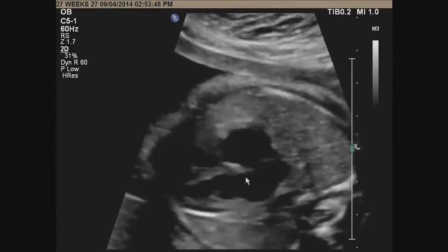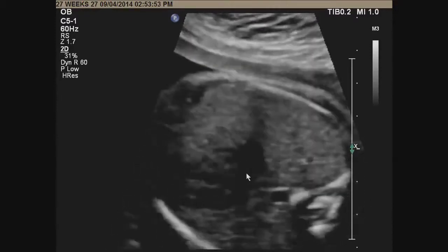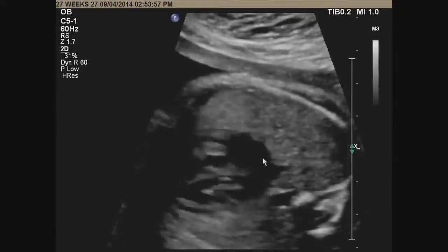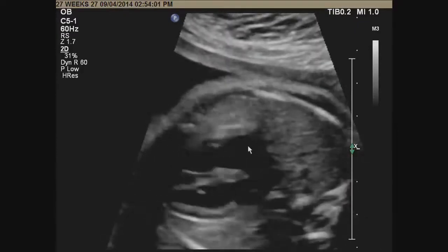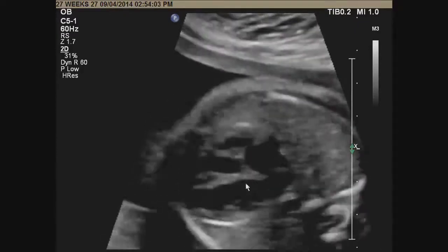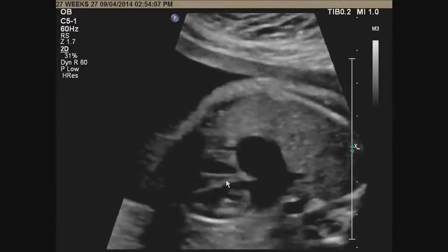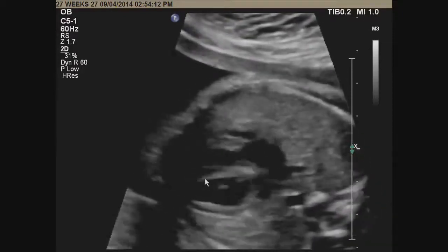Now I'm going to look at the atrial and ventricular septum. I'm going to look at the atrial septum right here. This is the septum primum area. I want to see that this is intact. Here's your foramen ovale, and you see the leaflet of the foramen nicely opening from right to left. And then I'm going to look at the ventricular septum. So I'm going to look at the integrity of the septum here in the 4-chamber view, at least on 2D. Then we'll try to look at color, and I'll show you.